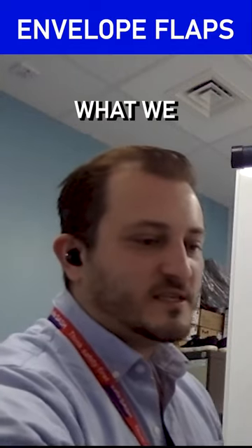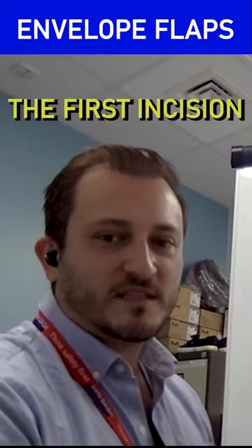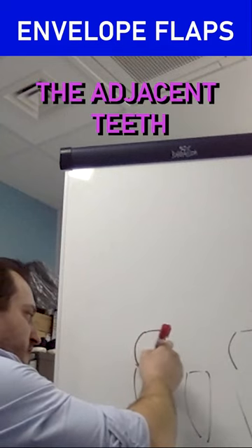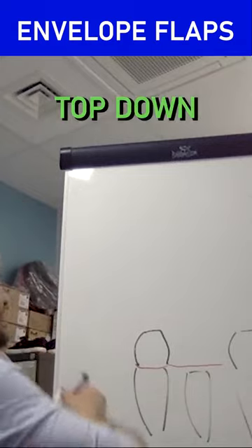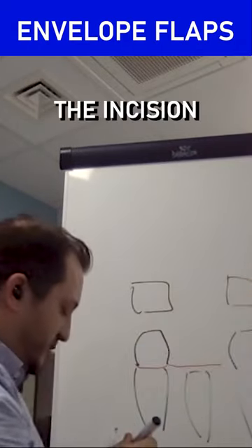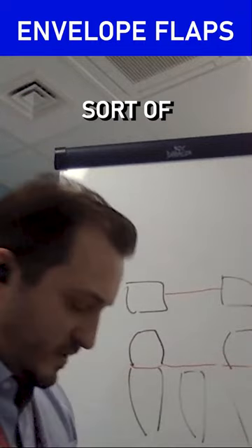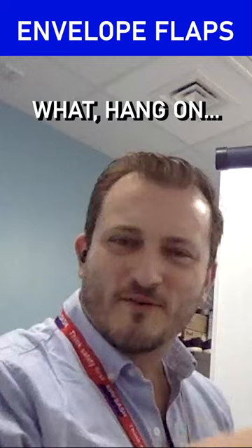The envelope flap is what we traditionally call the single-sided flap. It's that first incision where you use your blade to gently trace the outline of the adjacent teeth. You can take it crestally — looking from the top down, the incision is in the midline along the crest. A lot of people look like sushi chefs when they're doing this, the way they're trying to fillet things.